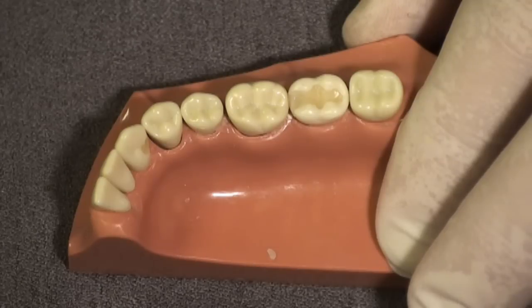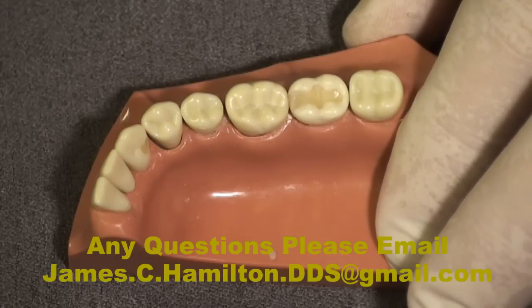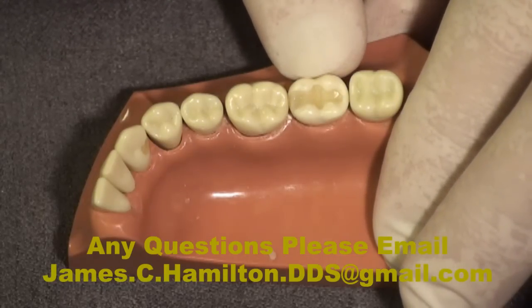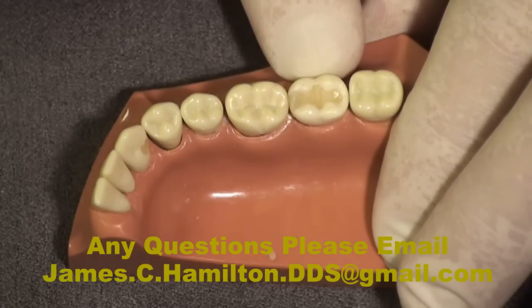I would check the occlusion with articulating paper and I'm almost 99% sure this patient will get up and walk out — except I need to do one more thing. I must cure this again because I'm not certain I got enough light energy through the custom matrix to completely cure it, so I cure it again for 20 seconds, the manufacturer's recommended time, and then the patient gets up and walks out.